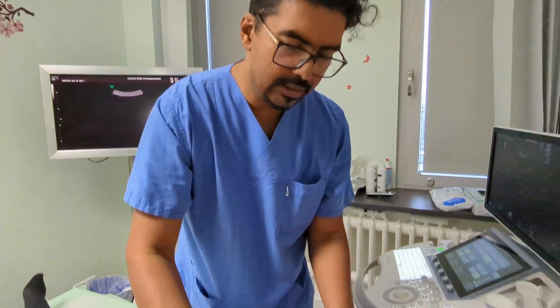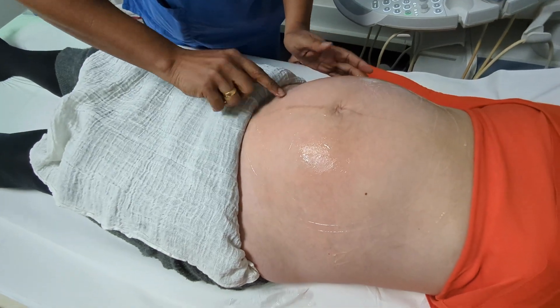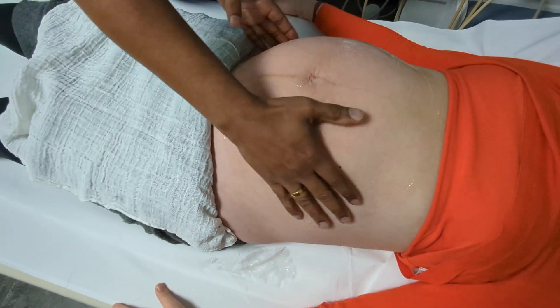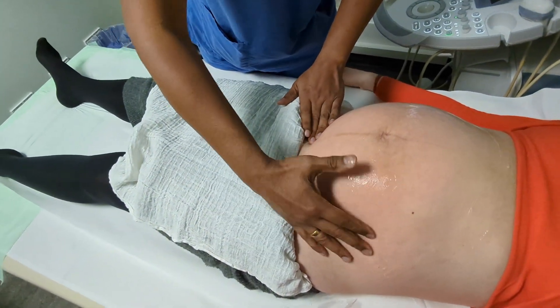The head is here, the back is here, the bottom is here, the legs are flexed. The umbilical cord is connected to the placenta and to baby, and there is adequate length of the umbilical cord to perform the external cephalic version.